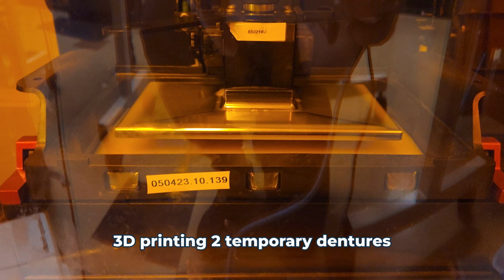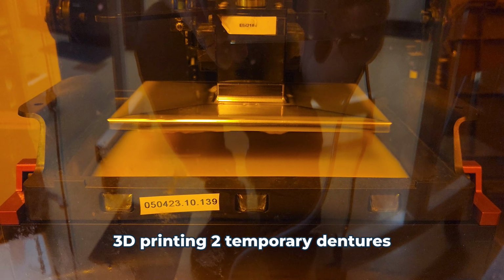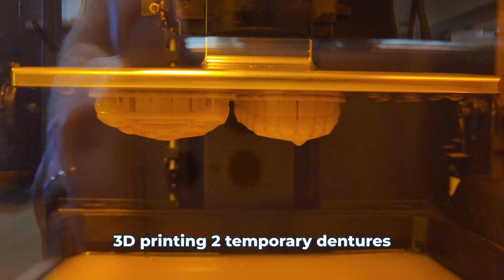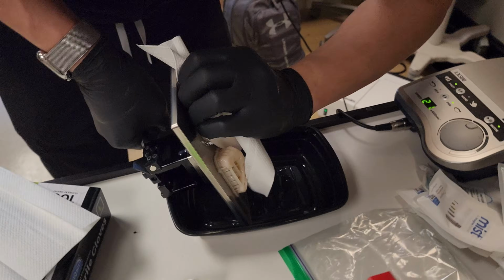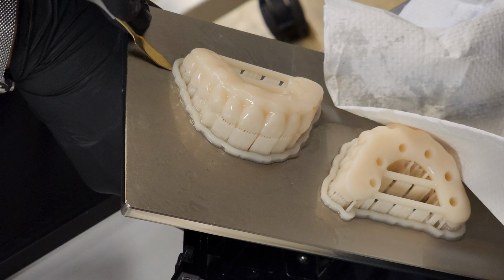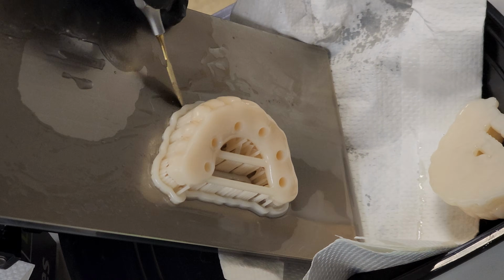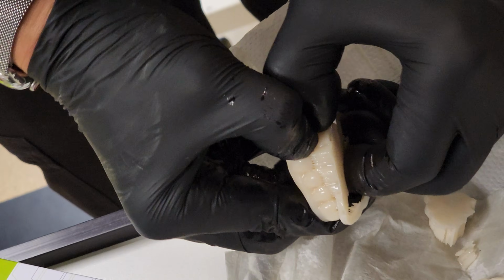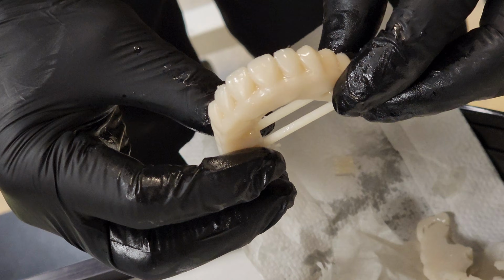If you have a great medical grade 3D printer, this won't take too long. And also just to note, we print 2 of these provisionals or temporary dentures in case something goes wrong, or just to have an extra one in the future in case we need it. Then we take those provisionals and break off the resin from the plate and break off the prosthesis from all the little supports that it's connected to. Next, like with any 3D printing of resin, we rinse the chemicals off the resin, wash them, and light cure the resin again for the final set.